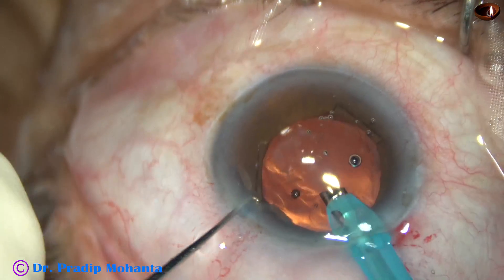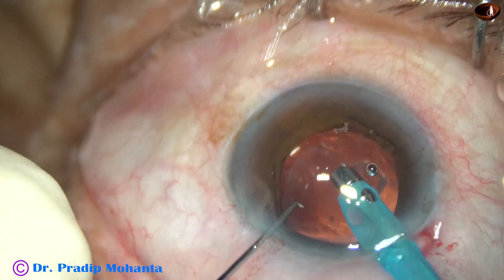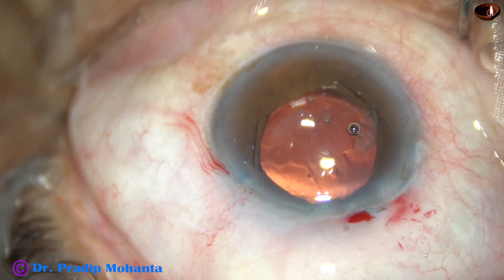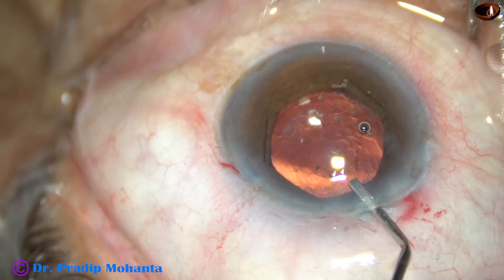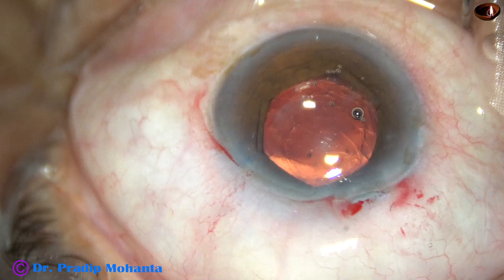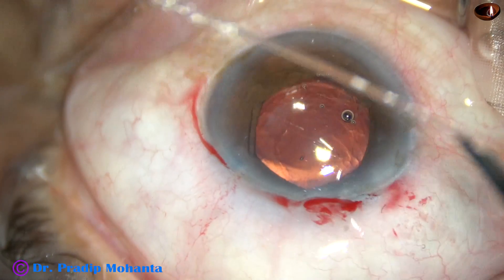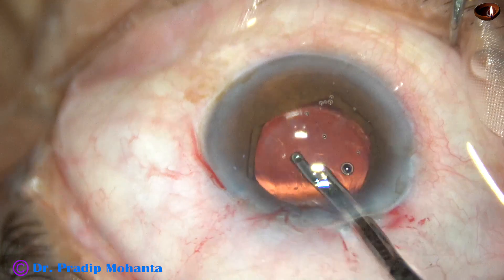So this is a very nice way of protecting the posterior capsule. When there is very little cortex or no epinucleus, we can implant the intraocular lens before emulsification of the last nuclear fragment. And if the last nuclear fragment is a big piece, we can emulsify it partially first.